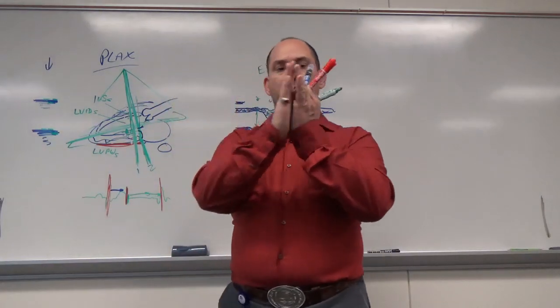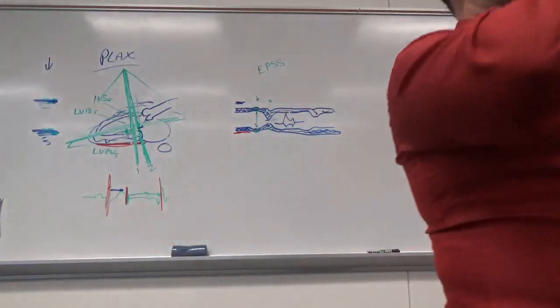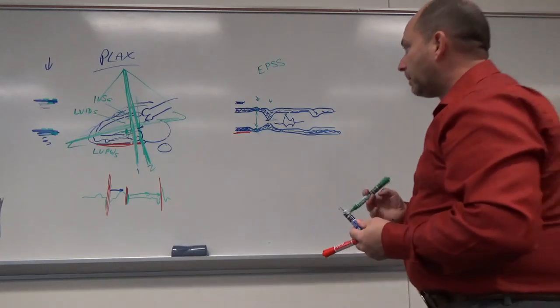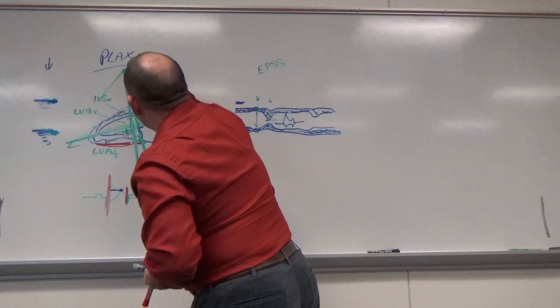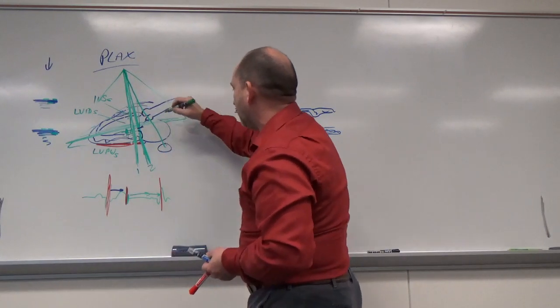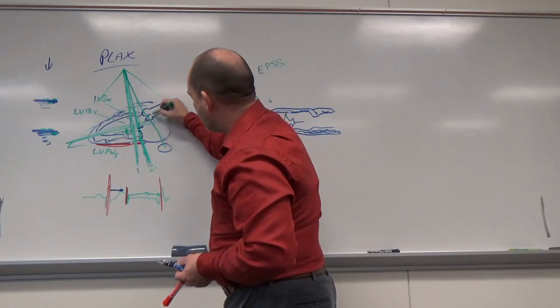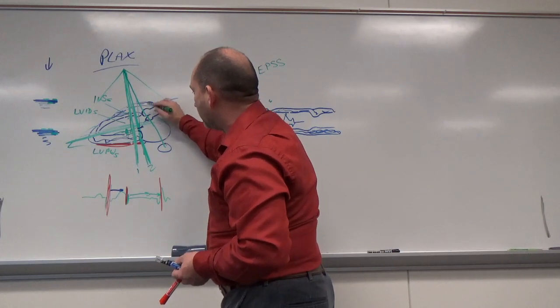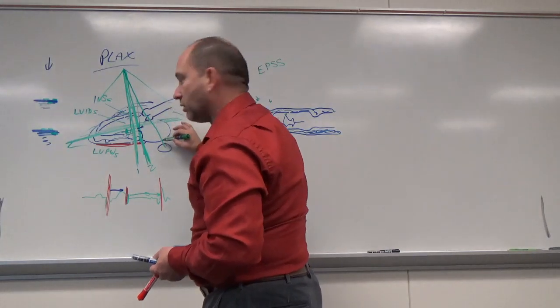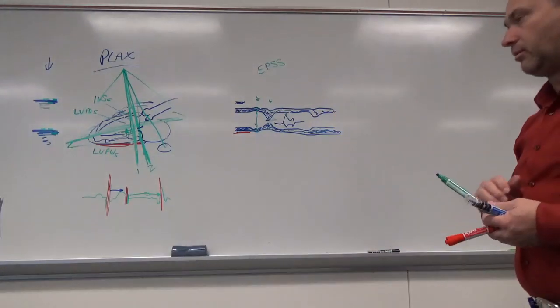It's got a coaptation, which means where the valve is shutting. That zona coapta is the area where the leaflets are touching together. So zona coapta is a name you want to be familiar with. That line goes right through those. It's perpendicular to that. It should be right at the tips. So I'm passing through some right ventricle. I'm passing through the aortic root, which is this, and sinuses of Valsalva, and it should technically be at the widest part of that. It goes through the tips of the leaflets and then through the left atria. Now ideally that's all lined up nicely. In reality it's never that clean.